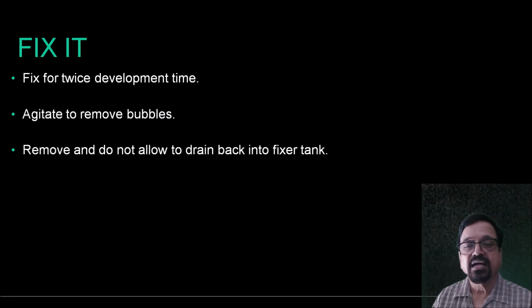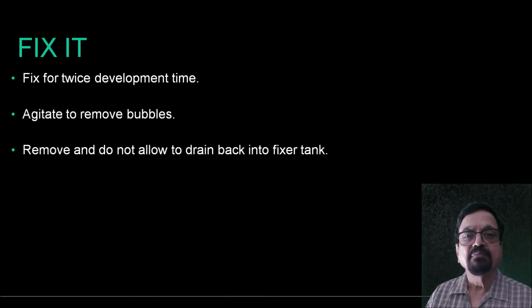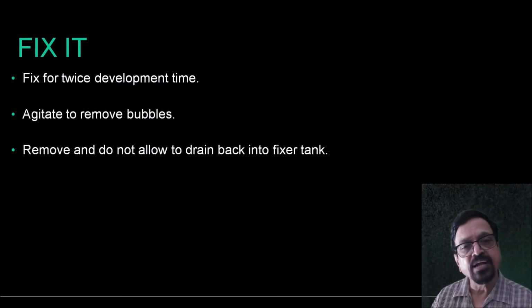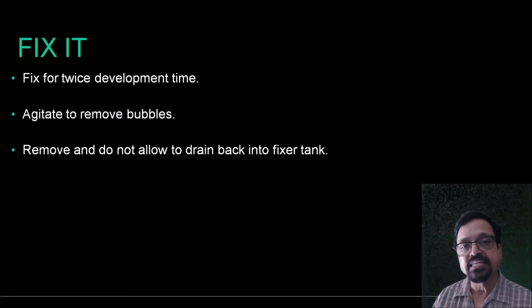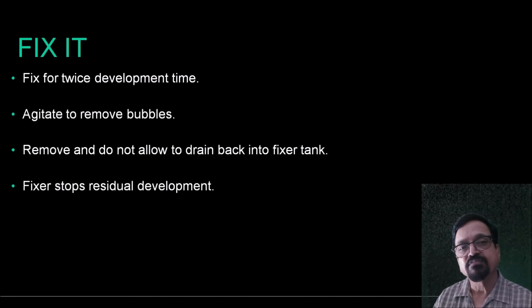So, once you are in the fixer, once you are fixing the film, by no cost should the film go back again to the developer. From the fixer, it has to go to water and water only. Because if you do it the other way, it will not only damage the film, and you will not get any results on it, but you will damage the developer also. So from the fixer, it has to go to the washing only.